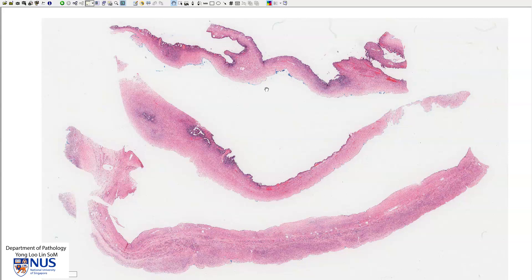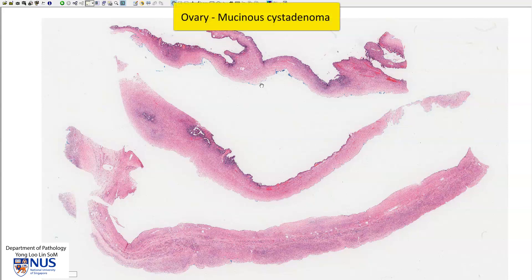This is a virtual microscopy slide of a mucinous cystadenoma of the ovary, which is a benign surface epithelial type tumor of the ovary.